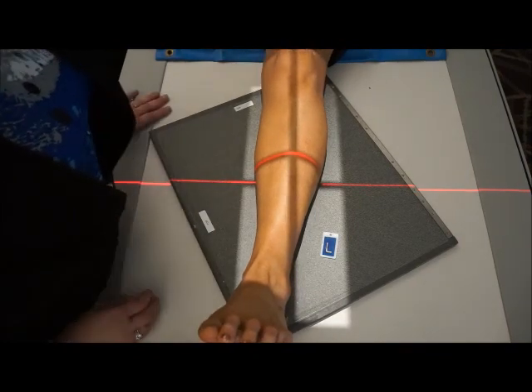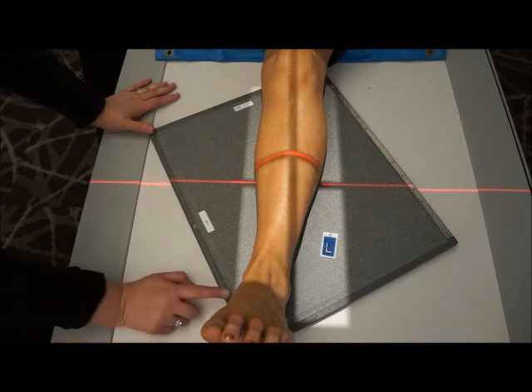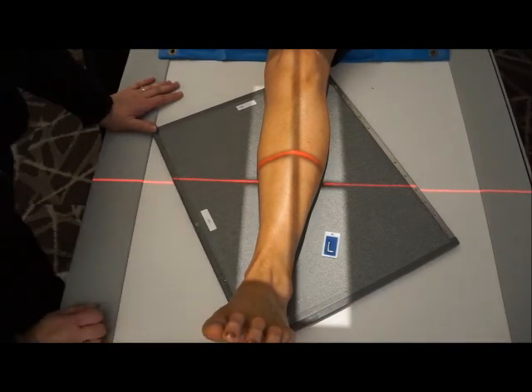And again we want a good knee joint. We want to make sure that we've got both malleoli in their entirety.